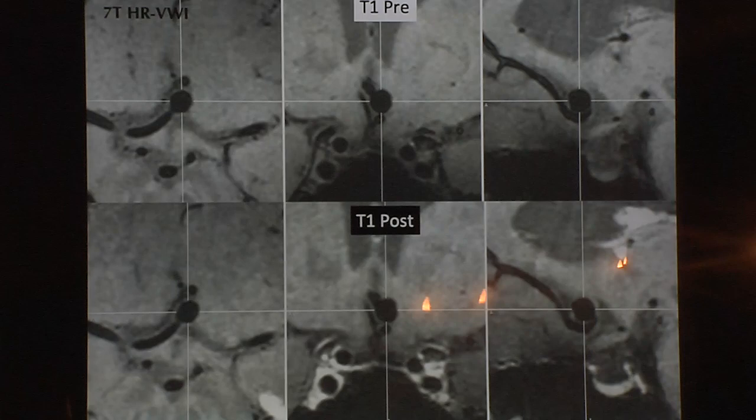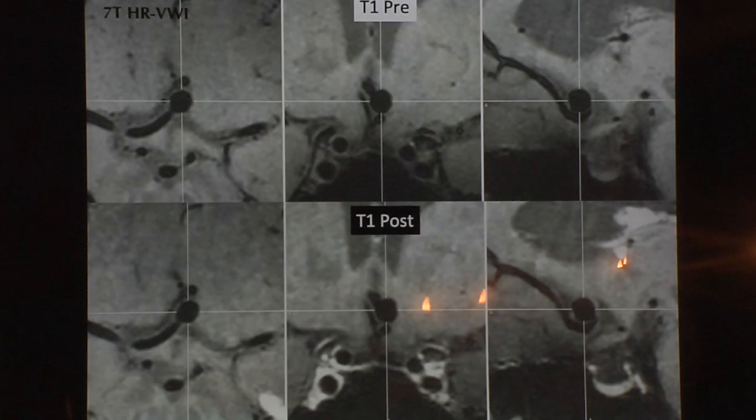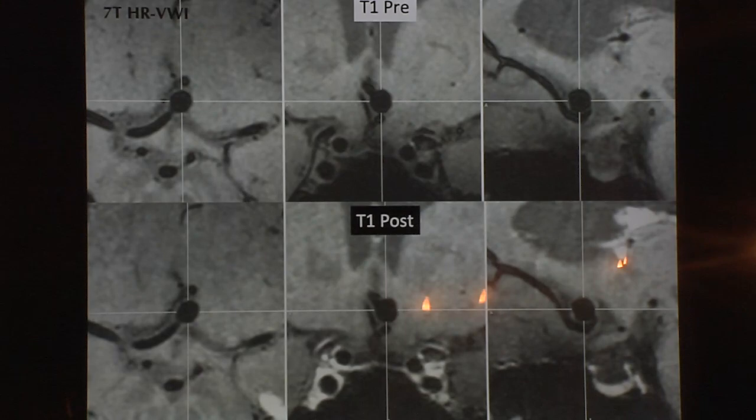That's why we analyzed aneurysms in Iowa. David started this protocol with high-resolution 3-Tesla MRI, and later I started doing 7-Tesla studies with aneurysm wall enhancement.